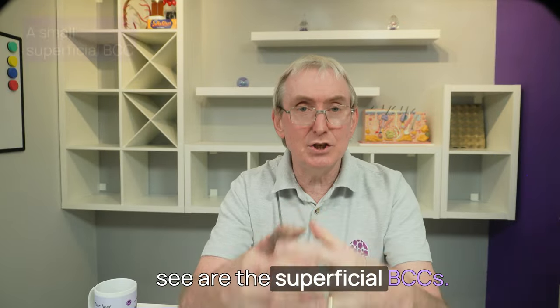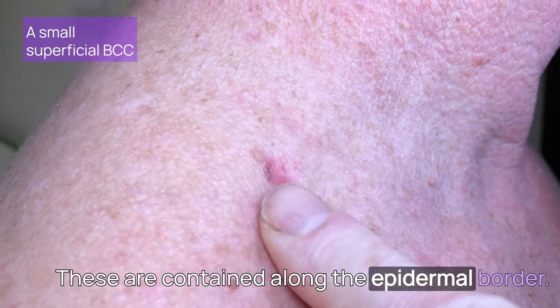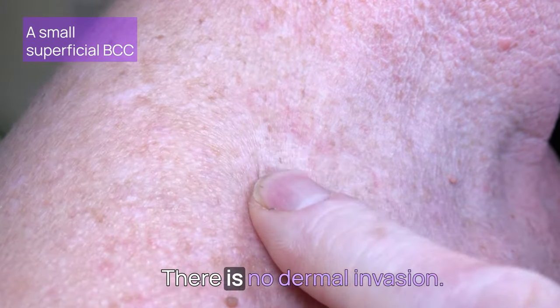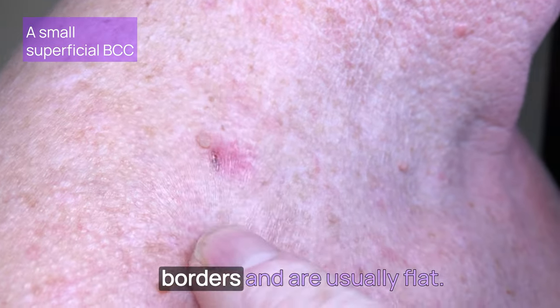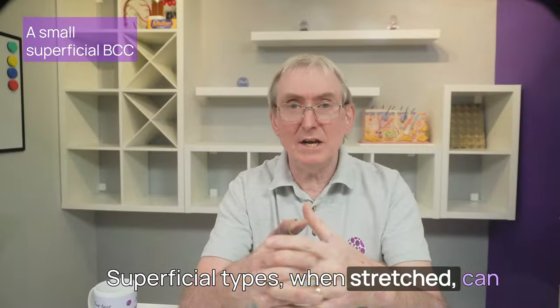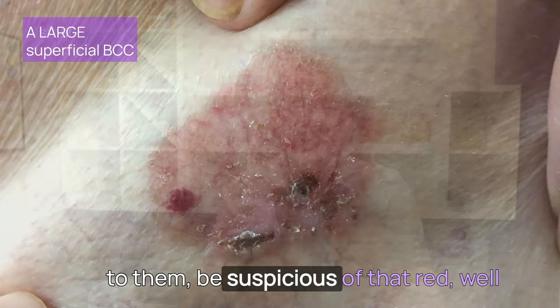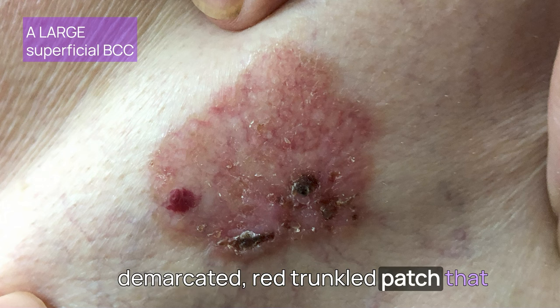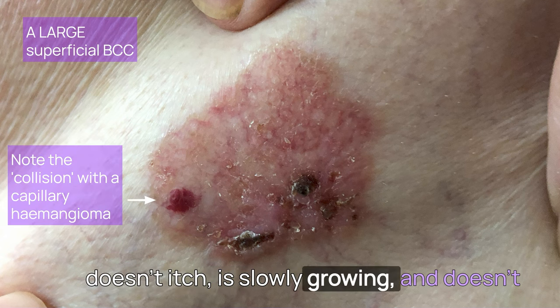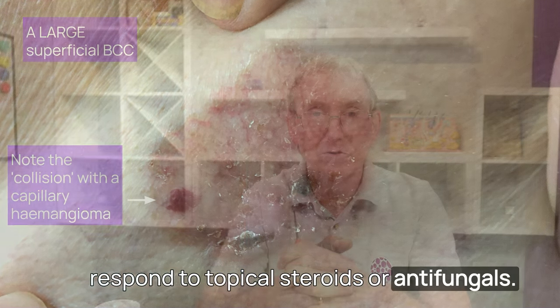The second type you'll tend to see are superficial BCCs. These are contained along the epidermal border — there is no dermal invasion. They tend to have well-defined borders and are usually flat. Superficial types, when stretched, can have what's called a whipcord edge. Be suspicious of that red, well-demarcated truncal patch that doesn't itch, is slowly growing, and doesn't respond to topical steroids or antifungals.